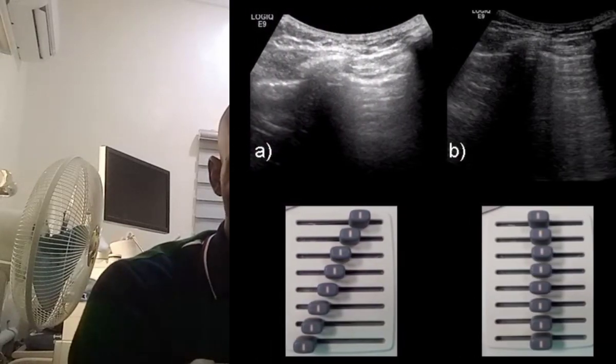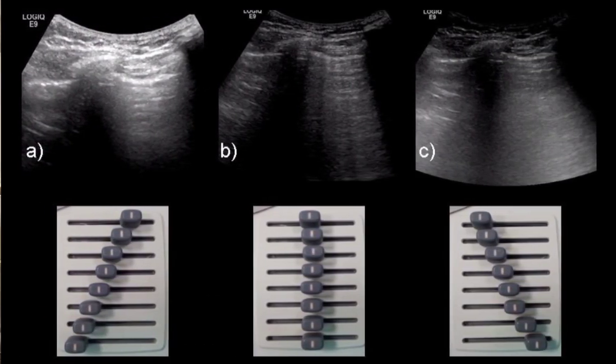Now, TGC applies more and more amplification to the echoes that have longer and longer go-return time and must have returned from deeper structures. So the TGC applies amplification in proportion to the echo time or the depth of the tissue. So it's also called depth gain compensation.